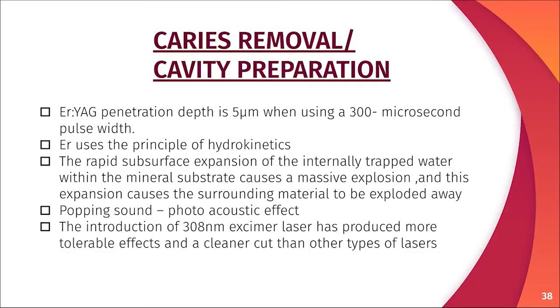Then the next one, caries removal or cavity preparation. We can use lasers to prepare a cavity. Mainly we use erbium-YAG lasers. Erbium uses the principle of hydrokinetics. Here, a rapid subsurface expansion of internally trapped water within the mineral substrate causes a massive explosion, and this explosion produces a popping sound, which is known as the photoacoustic effect.